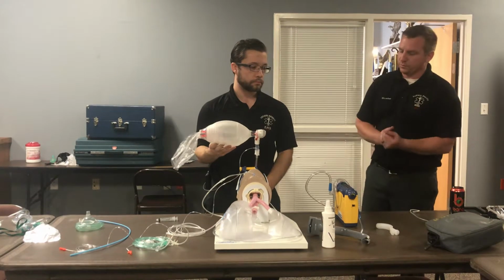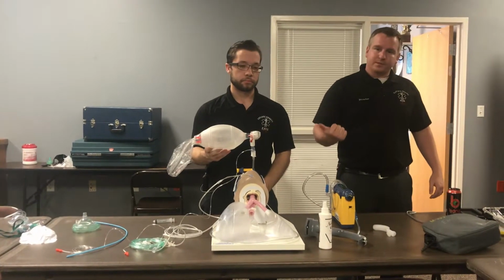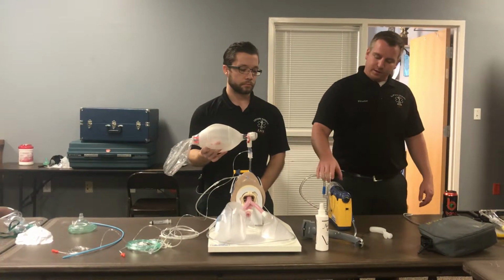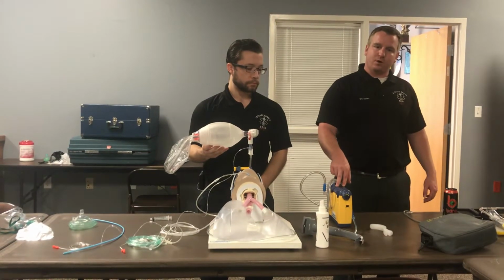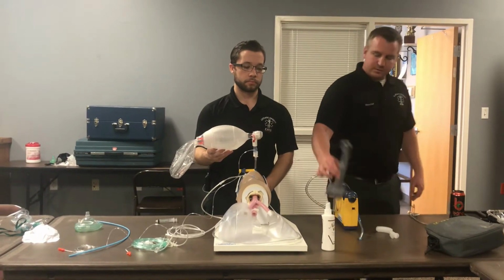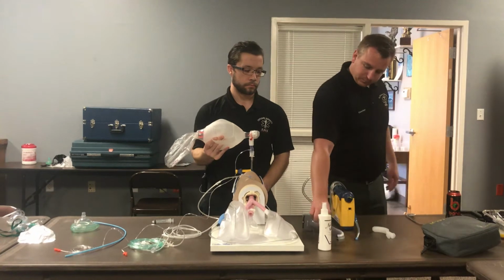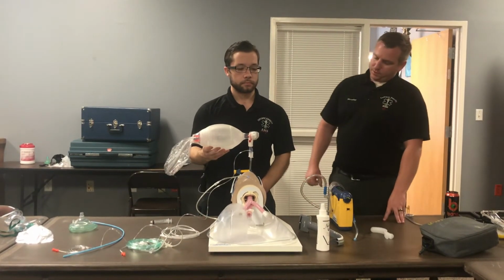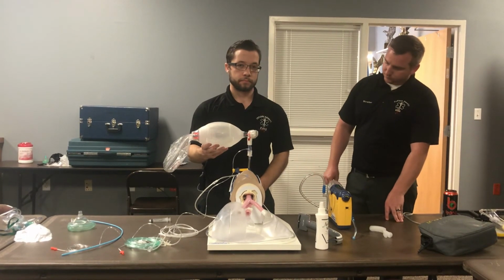Alright, so this is the procedure that Dr. Brott, your medical director, wants to see for RSI. In summary, proper oxygenation before intubation, proper preparation before intubation. That includes the fact that you are never going to intubate without suction on and present and in use. Use the device that gives you the best chance for success the first time, every time. And be prepared for continued sedation and paralytics after you've intubated. And that's it.